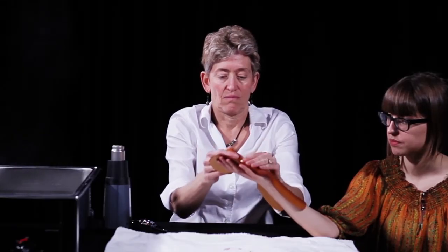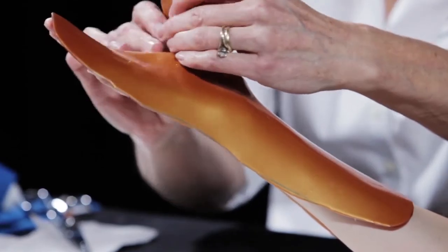Place the orthosis over the patient's hand, wrist, and forearm, letting gravity assist.